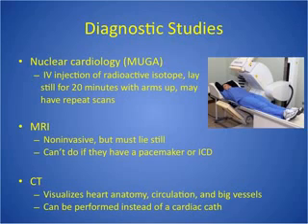MRIs let us see really small things, like a small MI that maybe they couldn't diagnose another way. It also can help predict how well they're going to recover after the MI, but they do not use it to diagnose CAD. CT would be more common to do than MRI probably, and it will visualize the heart anatomy, circulation, and those vessels. It may or may not involve IV contrast, so it can and it cannot.